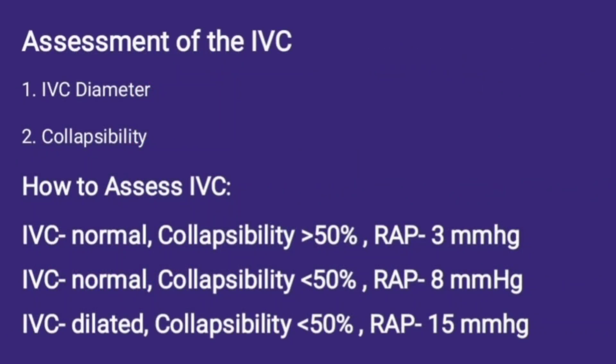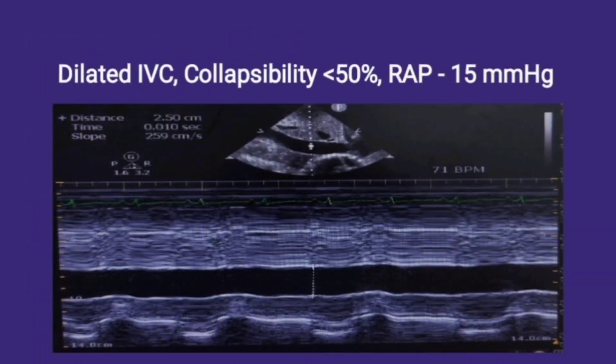The final parameter for assessing pulmonary hypertension includes evaluation of the inferior vena cava. We assess the IVC diameter and its collapsibility with respiration. An IVC diameter of more than 20 mm is considered dilated, with collapsibility of less than 50% and a RAP of 15 mmHg, which ultimately suggests increased PA pressures.